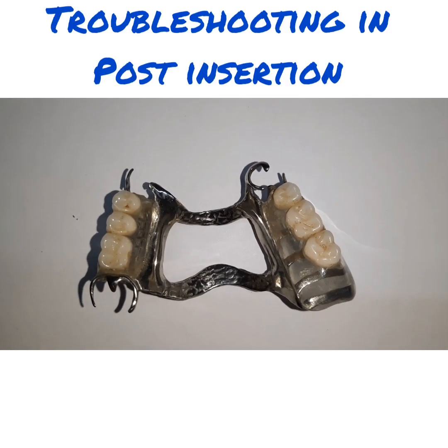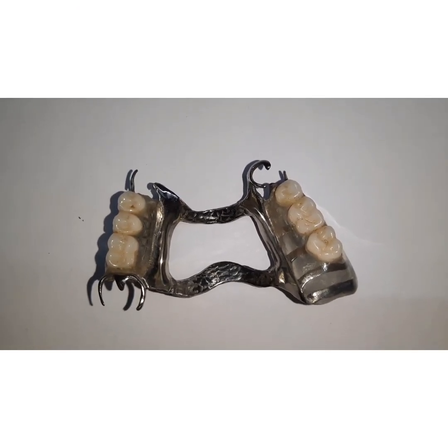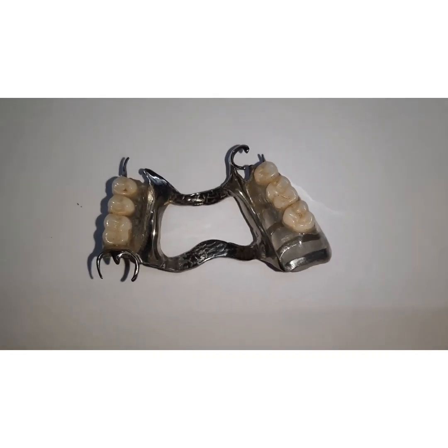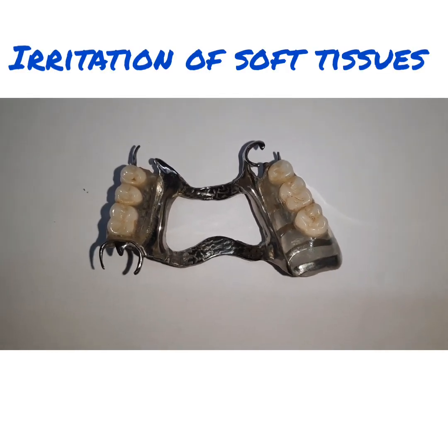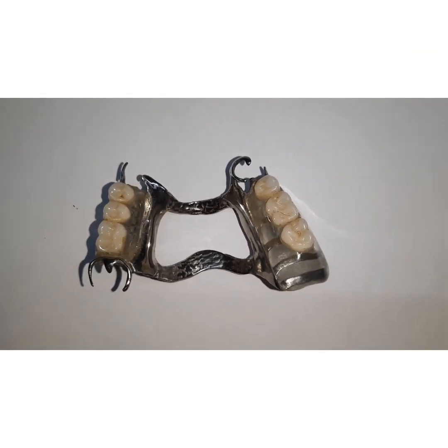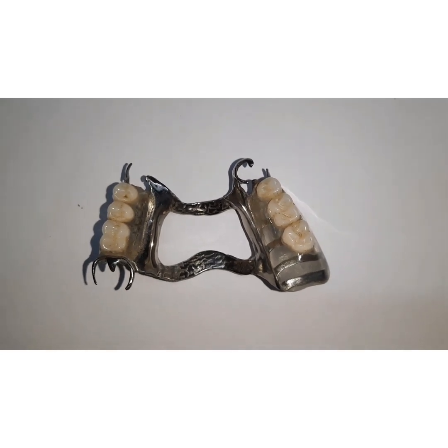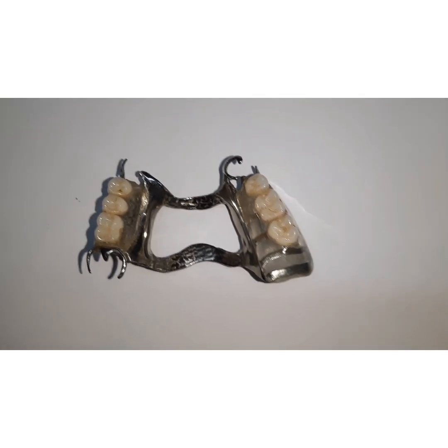Apart from this, troubleshooting can occur during post insertion. Once you have inserted the denture, you call the patient after a day, that is after 24 hours, and you have to check for any irritation of the soft tissue or any irritation of the hard tissue, or there could be miscellaneous problems. So troubleshooting for irritation of the soft tissues can be due to an overextended denture base. As I said when we were checking the fit of the prosthesis, the same thing you have to follow: apply the pressure indicating paste on the concerned side with the help of a brush, and then again place it there and check for the movement.